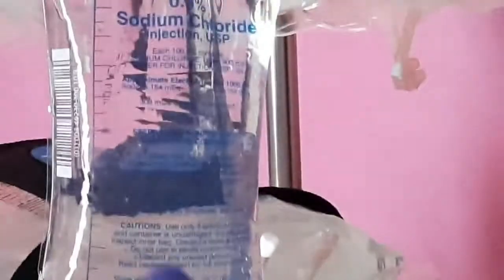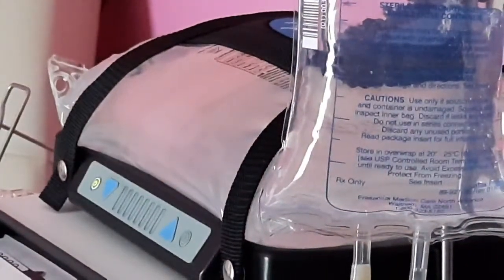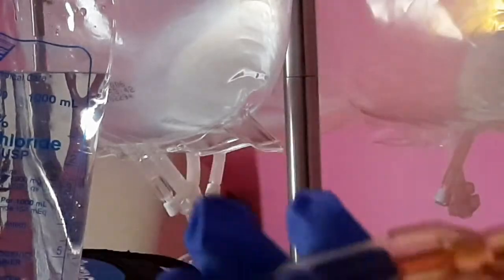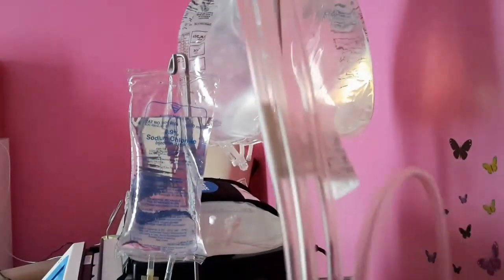Now we've got to connect our dialysate bags, the dialysate bag on the warmer, okay, and then we'll move on from there. So let me go get that MLA line. Okay, this is our multi-line adapter, see it's got a spike too. So, this one, some lines come with more attachments because some people use more bags. I only use four. I only need three lines. This has four lines. I only need three. So I'm gonna drop one and keep the three closest together.